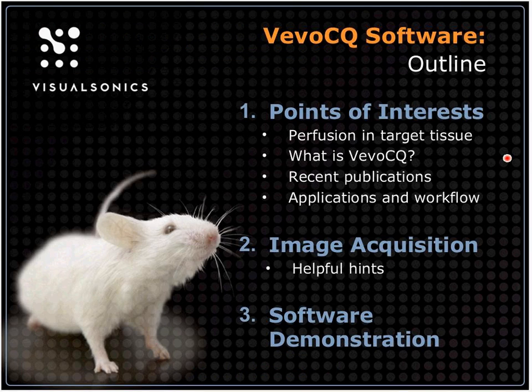I'll give you an outline of what we're planning on heading through here in this presentation. As Andrew said, we'll do a presentation. We'll take a little pause for any questions that may have come up during that short presentation, and then we'll move into a demonstration of the actual software itself and some of the capabilities.